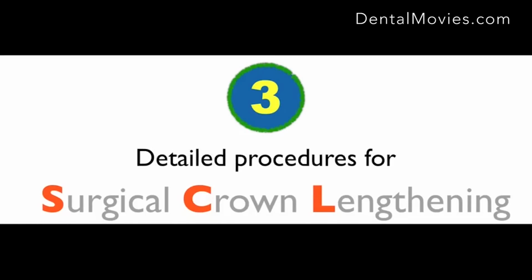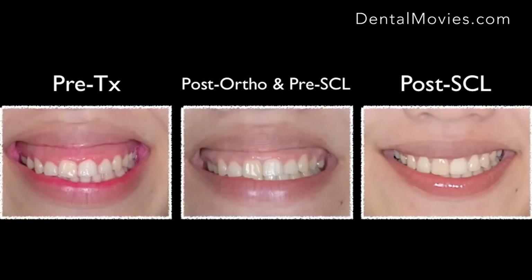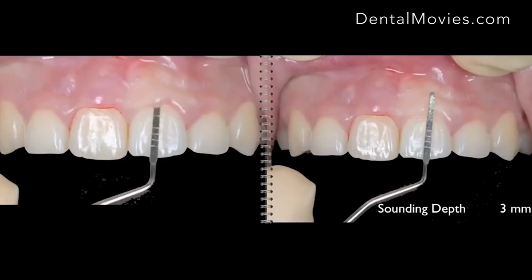So let me go through the detailed procedure for surgical crown lengthening, from the big gummy smile to small gum. This is post orthodontic treatment, pre-surgical crown lengthening. This is post-surgical crown lengthening. And let me show you how we did it. First, we get local anesthesia with sounding.